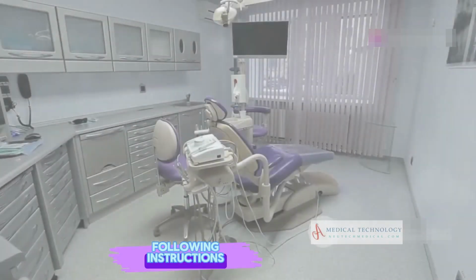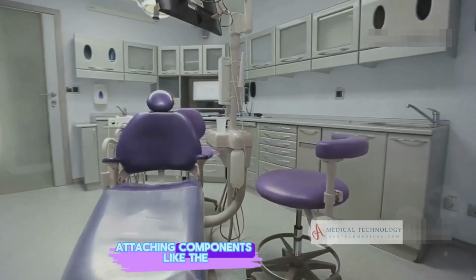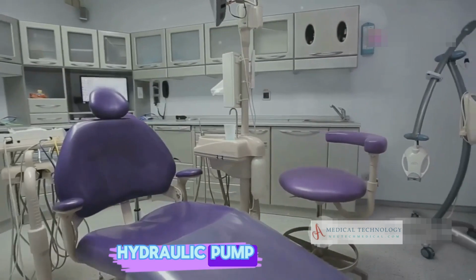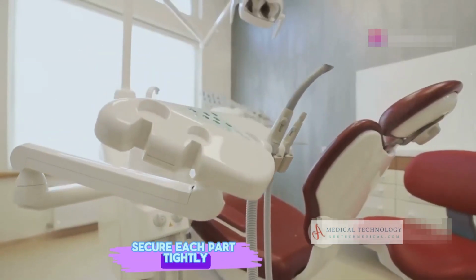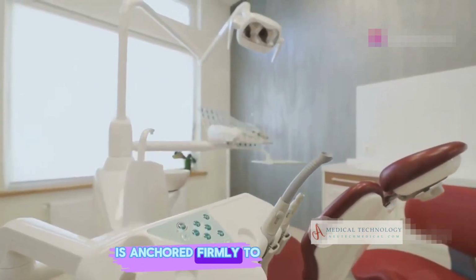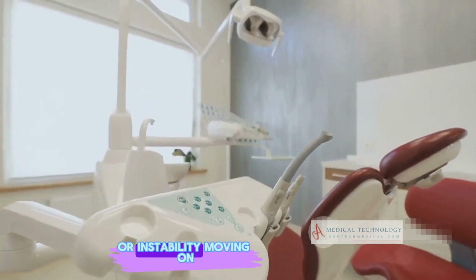Next up, assembling the base plate is more than just following instructions. It's about creating a sturdy foundation. Attaching components like the chair base, hydraulic pump, and support structures must be done meticulously. Secure each part tightly, ensuring the base plate is anchored firmly to the floor. This careful assembly prevents any future wobbling or instability.